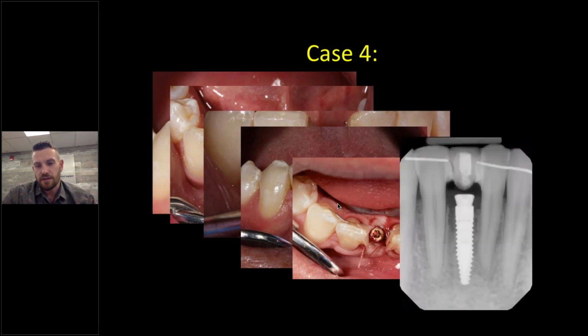And that's what the implant looks like after 3 months, with the provisional restoration that I really hate on there. And he should be coming back to us pretty soon for a crown. A common theme you're going to see with my cases is that they're all pretty new, so a lot of them don't have the final restoration present yet. If we had touched on this in maybe 6 months to a year, I'd have all the final cases to show, but that's not where we're at right now, and COVID-19 hit, so we're presenting it now.